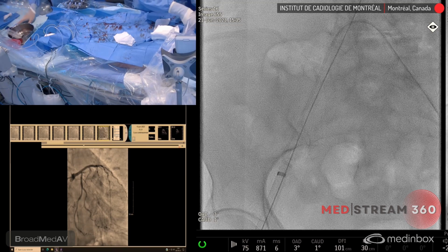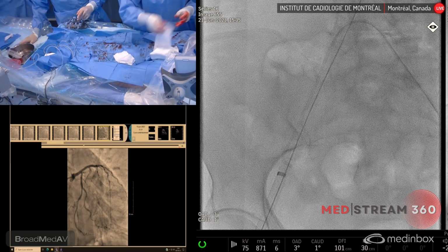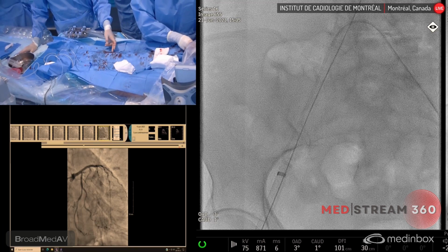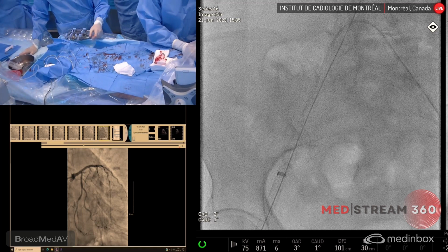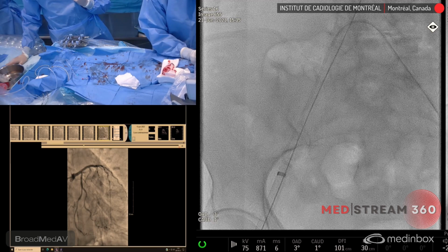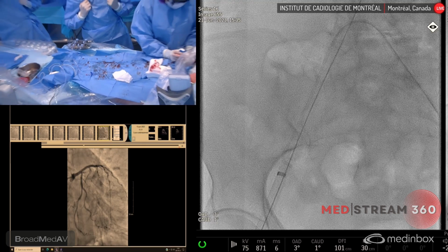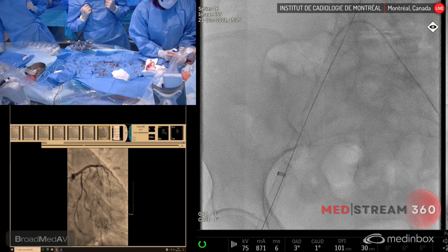So in with the Manta. Make sure I can click. Okay, I'm just going to make sure we can see the measurement. Okay, so I'm going to call out the numbers. Okay, so I'm at 10, 9, 8. Do you see me? Yeah. Oh, you see the wire? 7, 6, 5. Anchors are open.